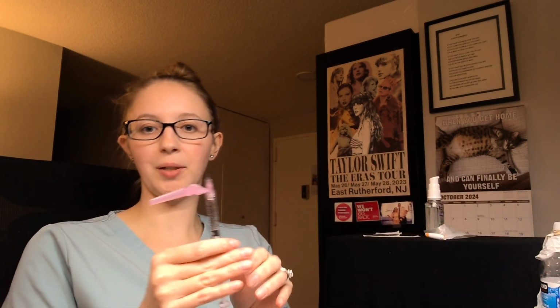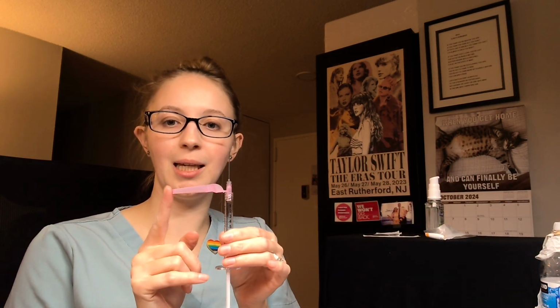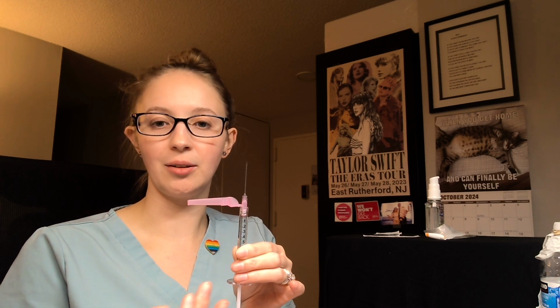And this is the point in time where you can actually use this pink cap, your safety cap, and you're just going to push that up all the way. This is what safely caps your needle.